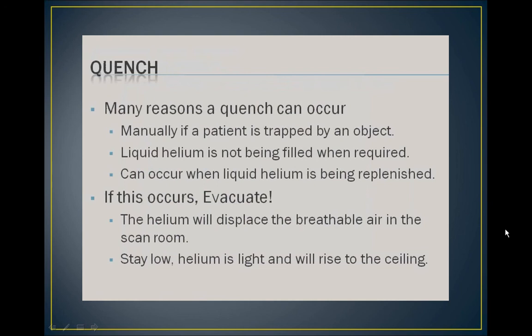In older negative pressure rooms, this is where the scan room door opens inward, you may need to break the MRI suite window to allow positive pressure into the room to be able to open the door to remove the patients. Newer MRI suites are designed so that the door opens outward and negative pressure in the room does not occur. If the door opens inward, this could potentially cause a vacuum, which will prevent you from opening the door and be the reason why you need to actually break the window.